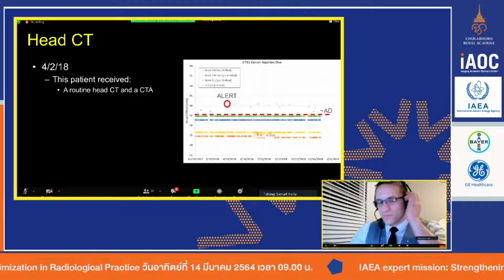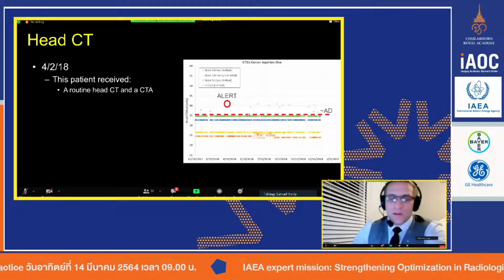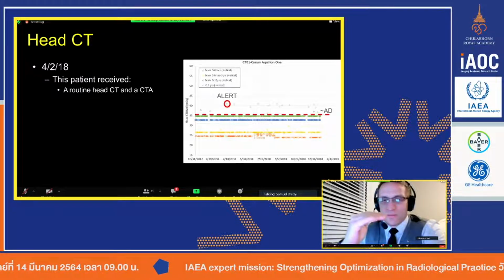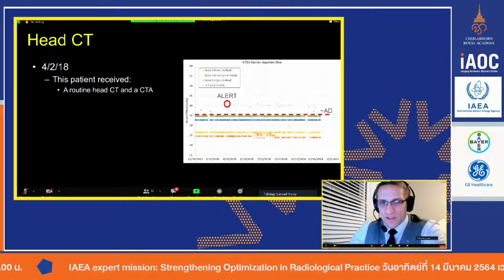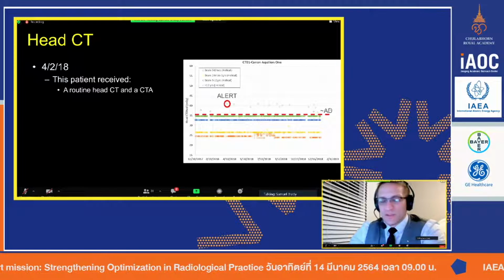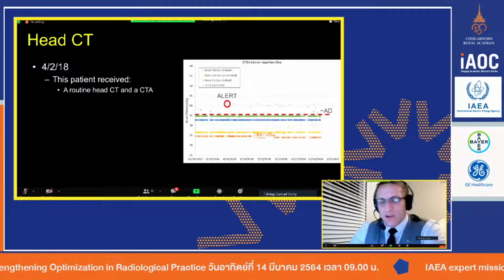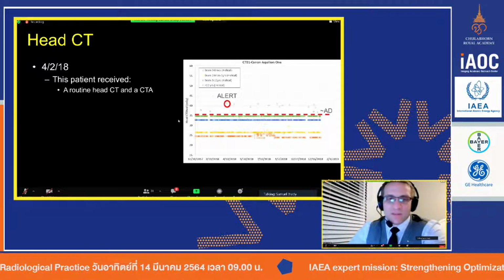Generally speaking, most of our data isn't causing an alert, but we wanted to set a value that, when something comes up above that alert level, it's obviously much higher than the value we expect it to be.